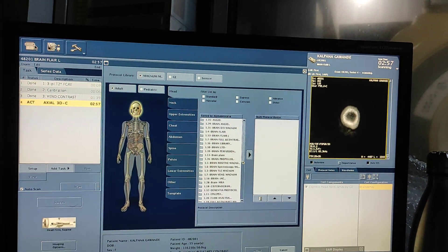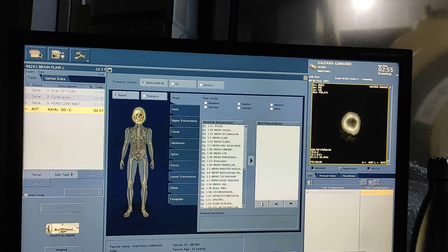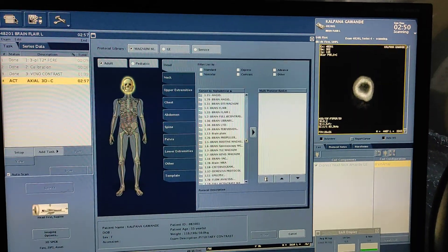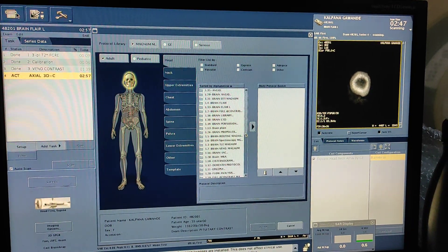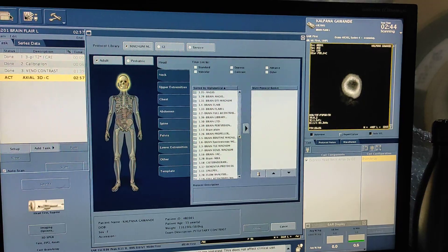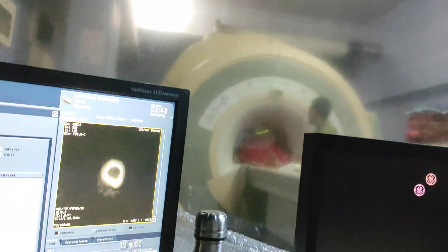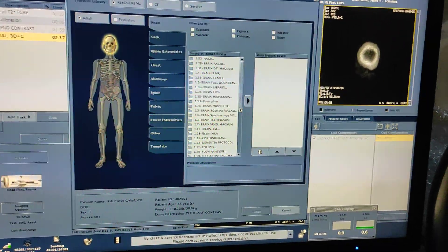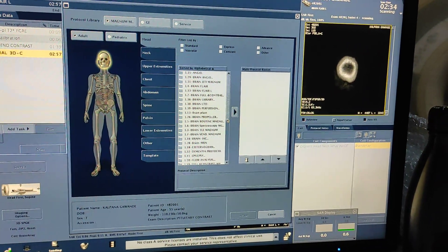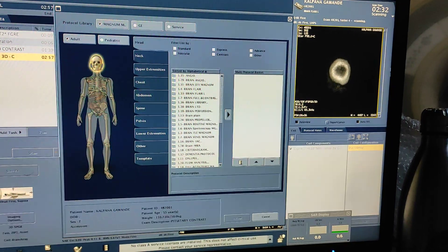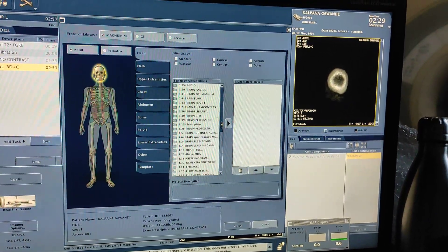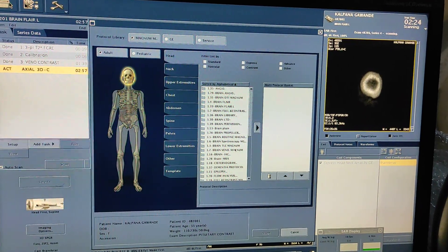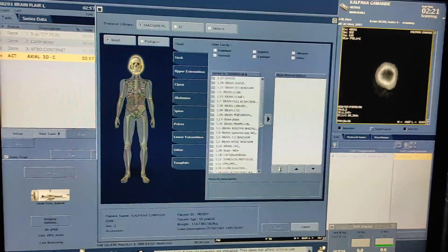As I showed you, I am doing a dynamic scan — the same scan I'm doing in this venography contrast. First you take a plain scan, then prep the scan, and ask the doctor to push the contrast. As soon as he starts pushing contrast, you start the scan. Arterial will come in the first phase and the second phase will be the delayed phase.